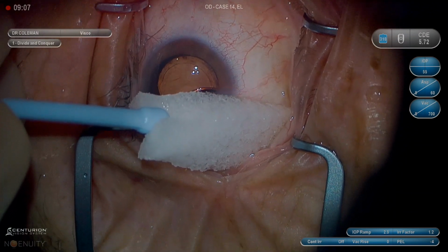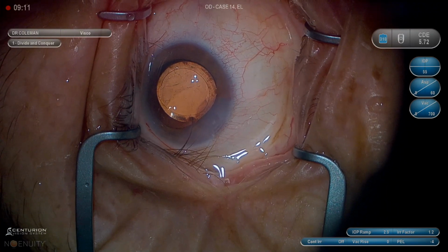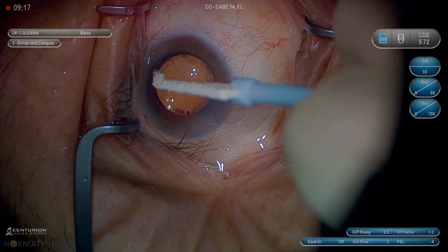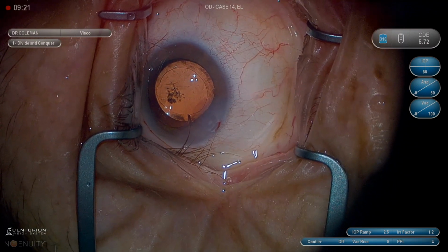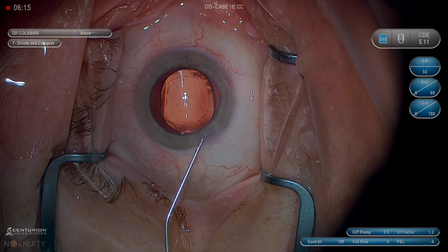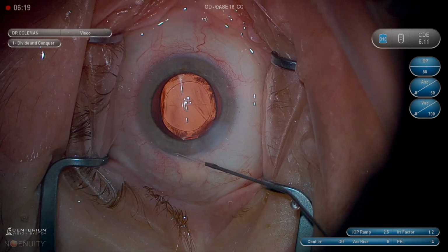Also, residents and fellows now with clear corneal incisions, we put so few stitches in, I think you get insufficient experience sewing a lot of times. When our fellows first start in our fellowship, we have them place 40 simple interrupted sutures in a model eye, just so that's second nature if it has to be done. Now we can see in that case that the tetracaine trick worked. The wound was tightly sealed, and we avoided a stitch even after the iris prolapse.